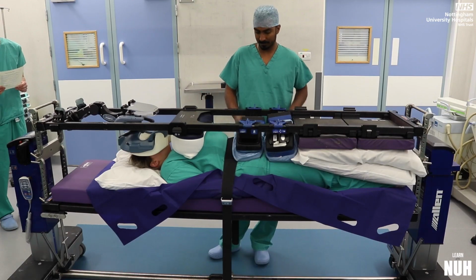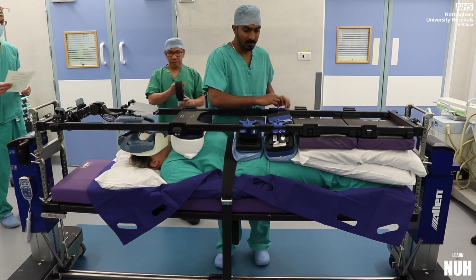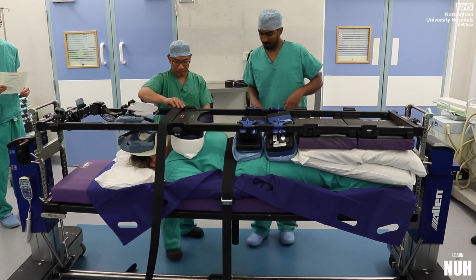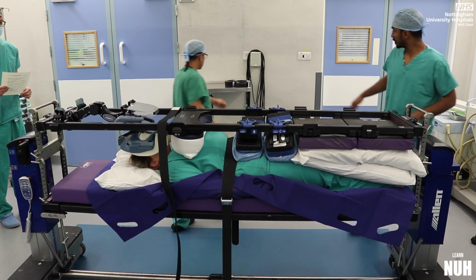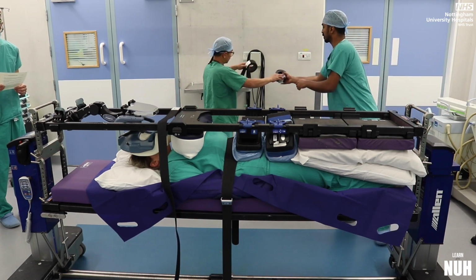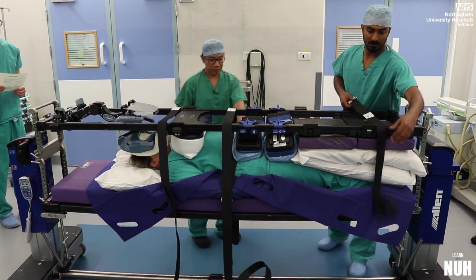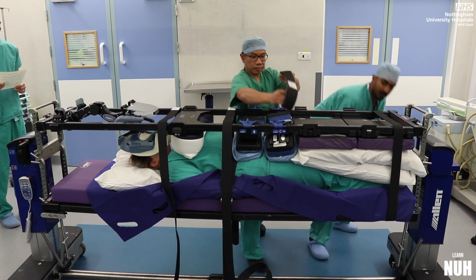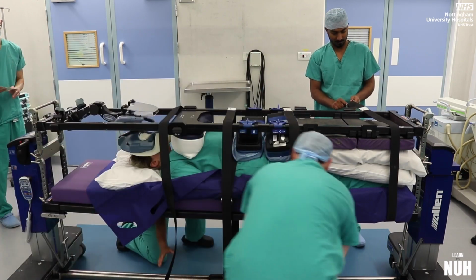Using 4 straps, secure the 2 frames together. Strap releases should be positioned so that they can easily be accessed following the proning process. The IV lines should run over the top frame and determine the direction of the turn. IV lines do not need to be disconnected, but if you are inexperienced, then you may wish to do so to prevent them from being accidentally dislodged.